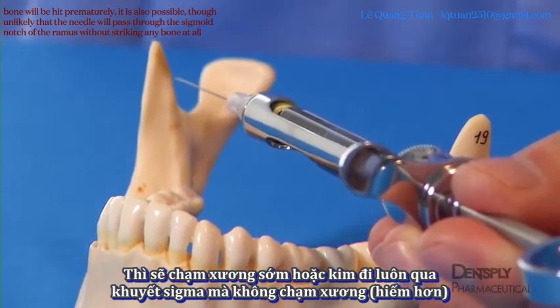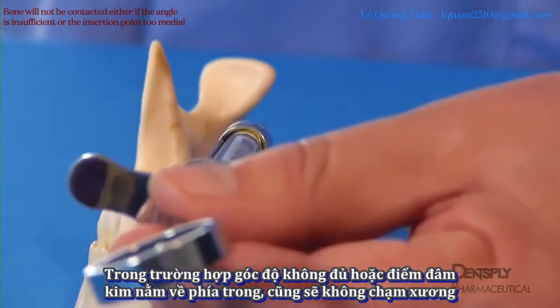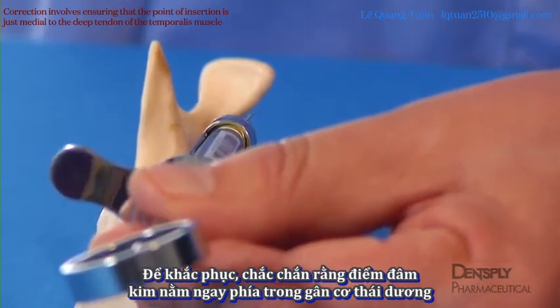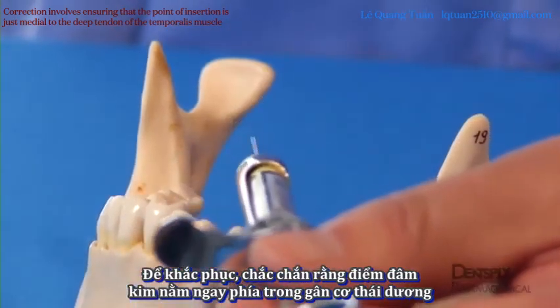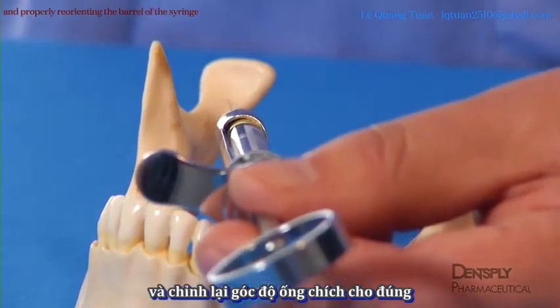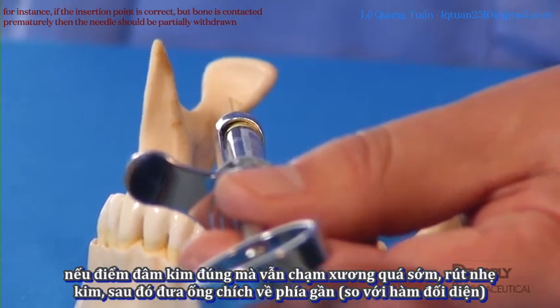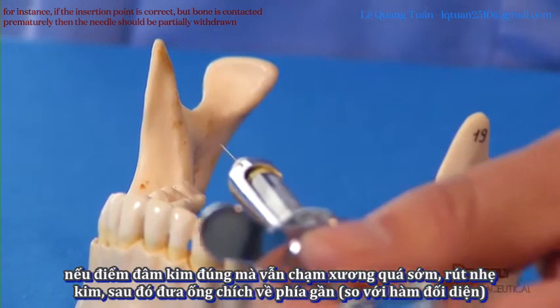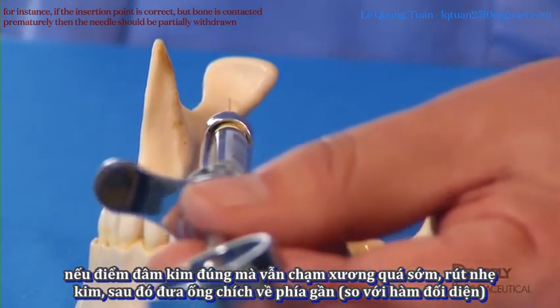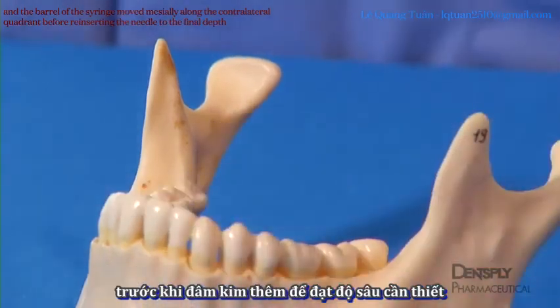any bone at all. Bone will not be contacted either if the angle is insufficient or the insertion point too medial. Correction involves ensuring that the point of insertion is just medial to the deep tendon of the temporalis muscle and appropriately reorienting the barrel of the syringe. For instance, if the insertion point is correct but bone is contacted prematurely, then the needle should be partially withdrawn and the barrel of the syringe moved mesially along the contralateral quadrant before reinserting the needle to the final depth.